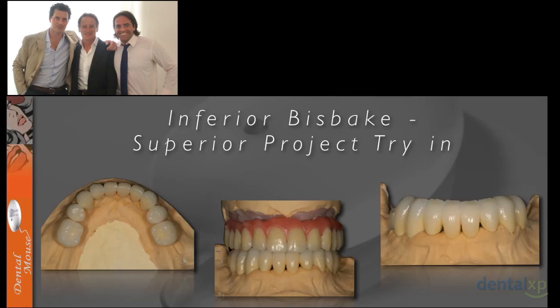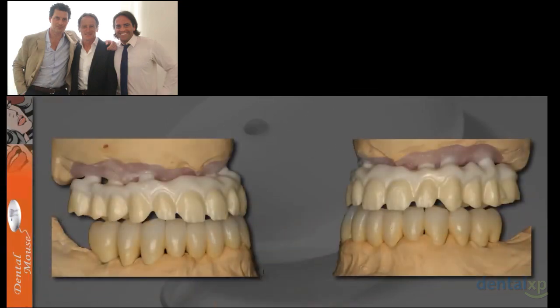So you can see that you can do some cross trying. Let's say you have an inferior bisque bake and you still have the superior project try-in that is always the same that we saw before, and we can have more control like this. So you can do this cross control always on mounted cast models.